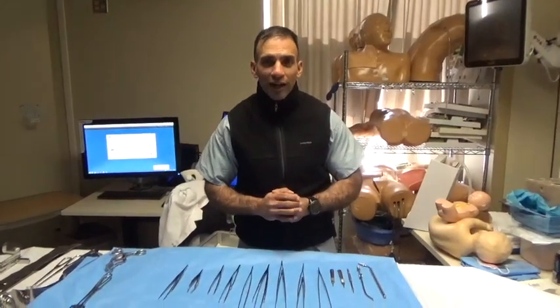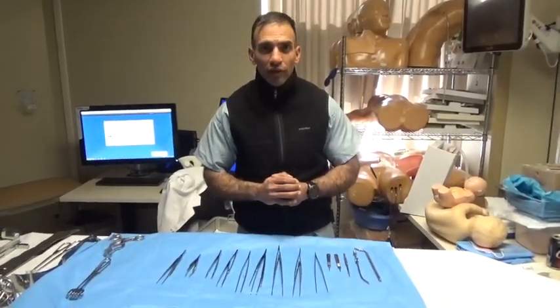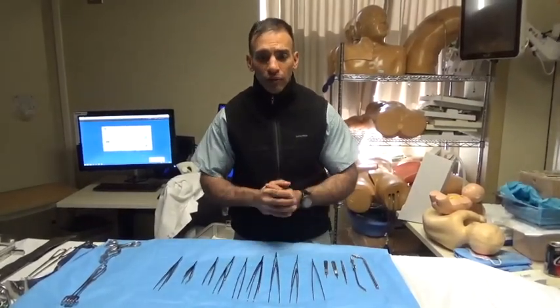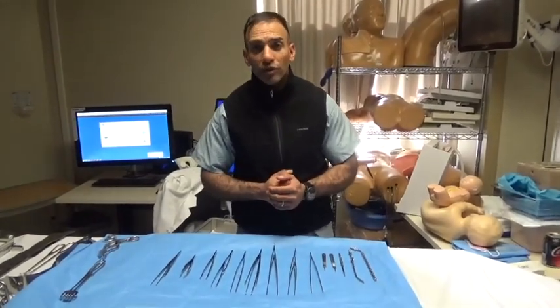Good afternoon. Welcome to Behind the Knife's skills videos. I'm a general surgeon in the Northwest, heavily involved with medical student education and simulation. Today I'd like to demonstrate a workshop that I usually do for our medical students once per rotation.